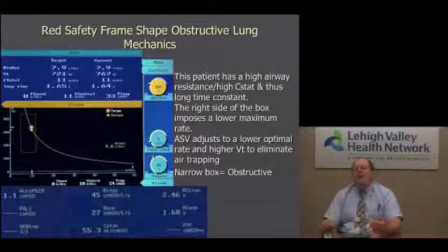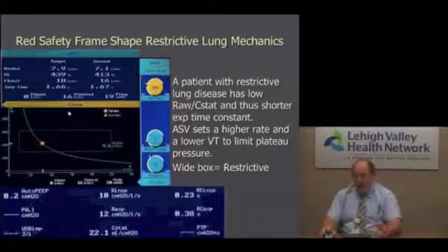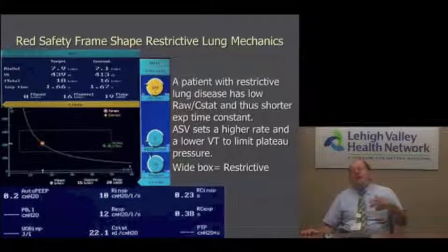So a ventilator would adjust this automatically. And the next scenario would be a patient developing something like ARDS, where the resistance is okay, but the compliance is now poor, so the tidal volume dropped and the respiratory rate went up. So it puts on an ARDSNet type of ventilatory strategy. The idea with this ventilation is that, instead of reacting, if you're in volume ventilation, causing high pressures, or if you're in pressure ventilation, causing low tidal volumes, the ventilator would adapt.